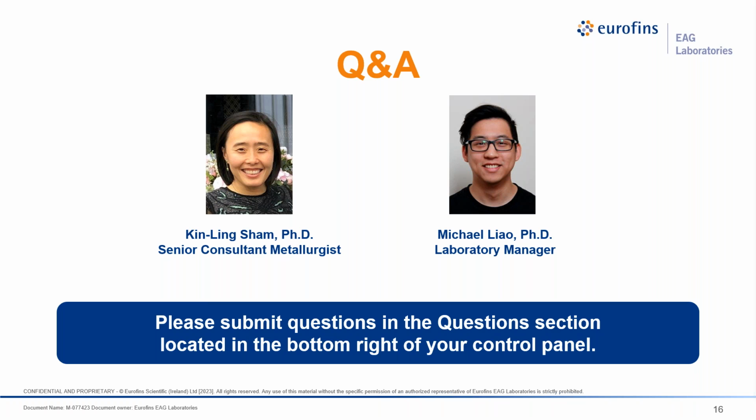So do remember, when we run this test, we want to run it in the condition in which the sample sees what the sample would see out in the field. And if someone would like to test something that has been in the body for 10 years, depending on what it does, we should mimic those 10 years, accelerate and mimic that, whether it's fatigue cycles or turning something on and off, right?